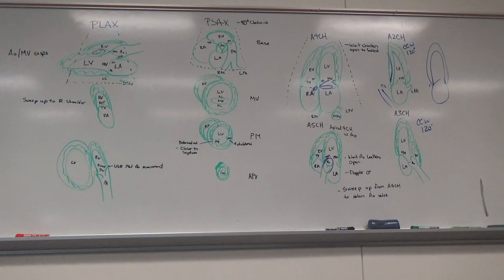And then it goes through extensively the echo stuff. So M mode and 2D, what do I need to see in that? What do I need to measure? Pulsed wave, continuous wave Doppler, transesophageal exams, and then differential diagnoses, and then other notes. Okay, so that's kind of how it breaks it down. So go through those things. So you want to have a pretty comprehensive knowledge of what happens from the time the patient walks in, the histories that they have, the kind of symptoms they're going to complain about, to the lab work, to what it is that I need to get on my echo, to what happens after the echo.